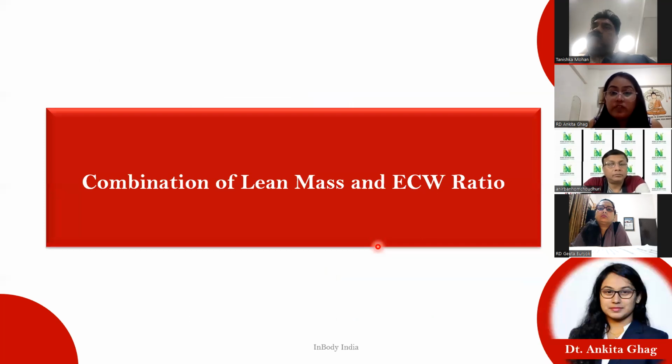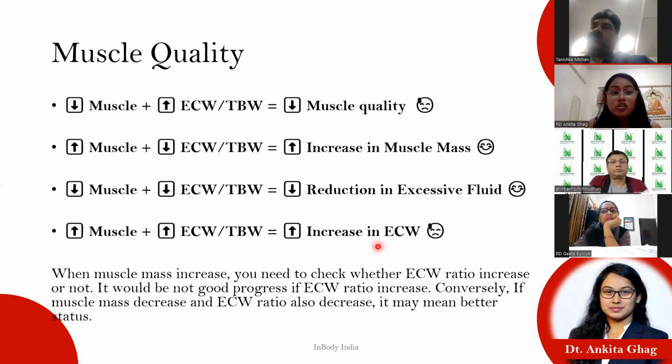Then the combination of lean and extracellular water becomes very interesting in order to assess the patients, and at the same time it helps us give a broader spectrum for the individuals. So now today when I'm assessing the patient, it's a follow-up case. So I see my patient is dropping muscle and increasing extracellular water.